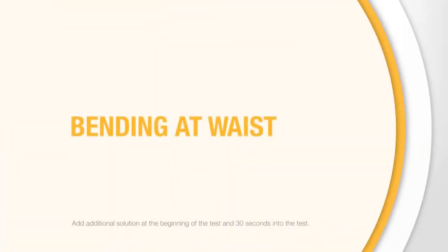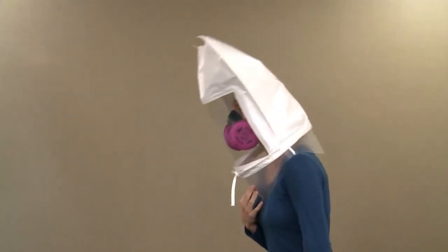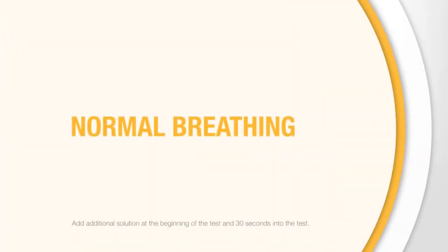6. Bend over. Bend at the waist as if touching your toes. Be sure to hold on to the hood when bending over. You may substitute jogging in place for this exercise. 7. Breathe normally again.